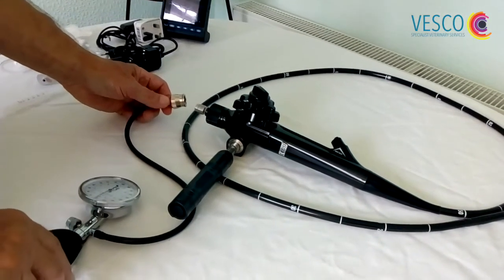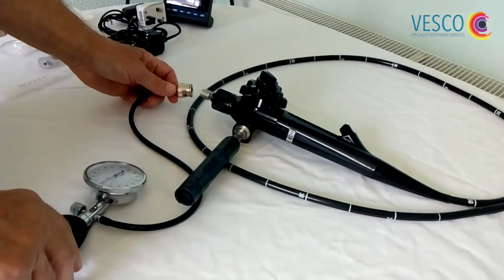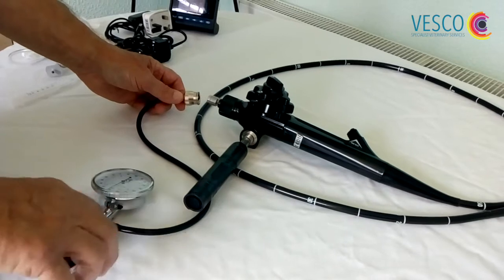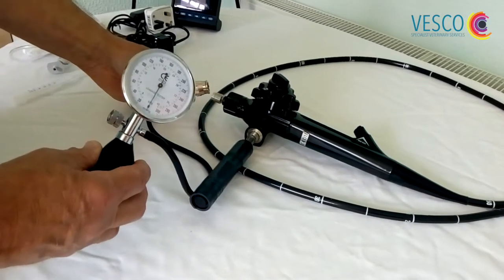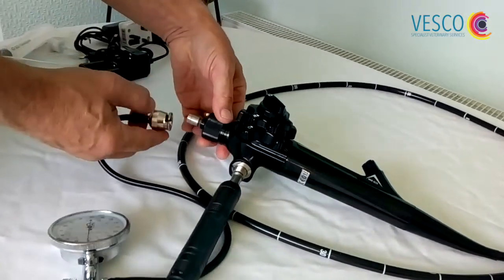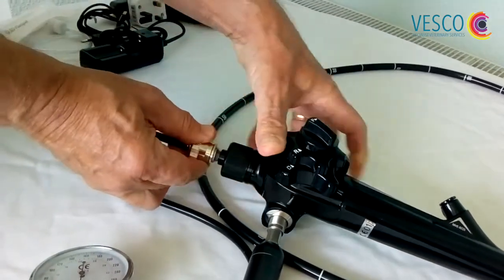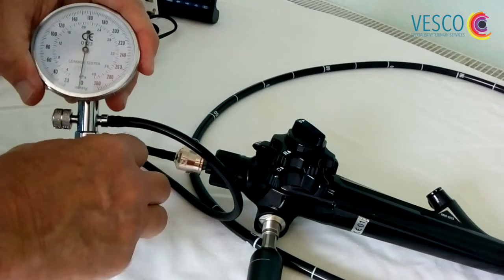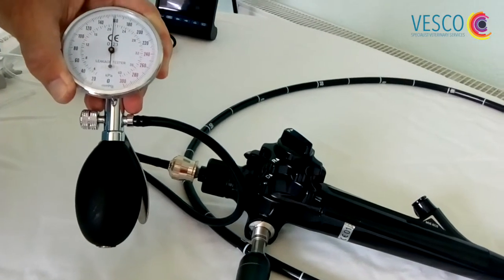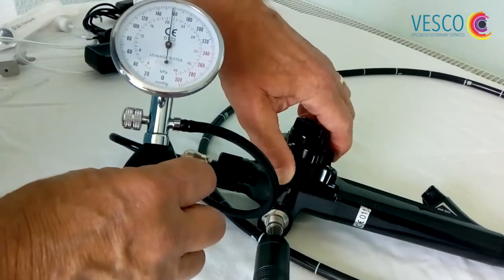Before we proceed any further, as with all endoscopy, it is very important that you leak test the scope prior to use, purely to make sure that you don't have any leaks. If the scope leaks, when the pressure drops from the leak tester, I would strongly advise against using the scope. On this particular model, we're going to attach the leak tester to the end of the scope, simply press and twist, and pump the scope up to around 160 on the gauge. Leave that to settle for maybe 30 seconds or so, but what is important is that we move the scope through all four angles.